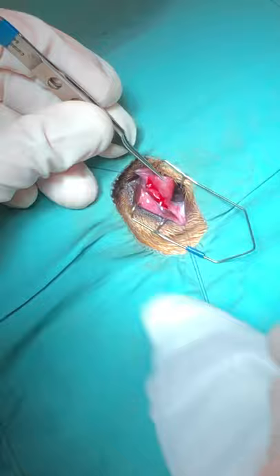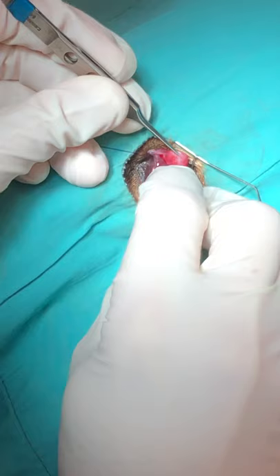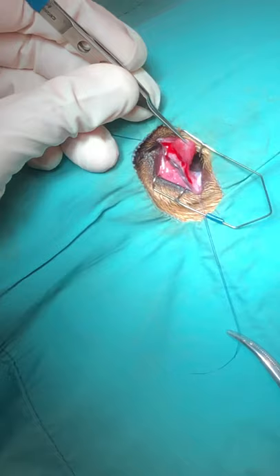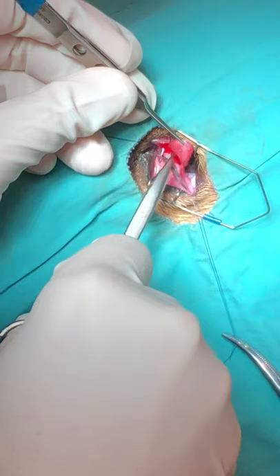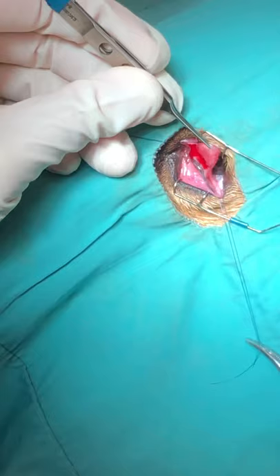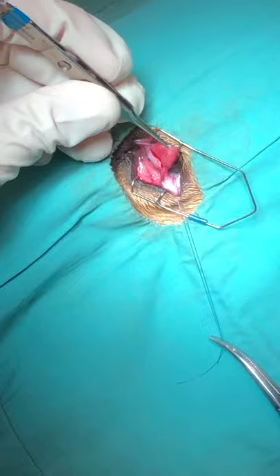You can see you're starting to get a little separation and a little pocket. Use really light pressure here. Then you can take your tenotomy scissors and try to create a little depth to this pocket — it doesn't have to be real dramatic, just enough to give you something to sew to.